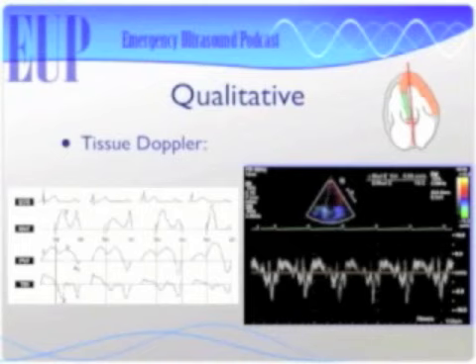Do I really need to know that? Yes. Because if it's greater than 8, then you're done. But can I just look at the A? I'd go with the number 2. Because the reason is because sometimes in restrictive, which is the one all the way on the right, sometimes your E prime is just a touch bigger than your A prime, but the velocity is really slow. You just told me. So if the velocity of E prime is really, really slow, like 2, then you can't just go with that. You got to look further, okay? Just work with me here. Got to be greater than 8.